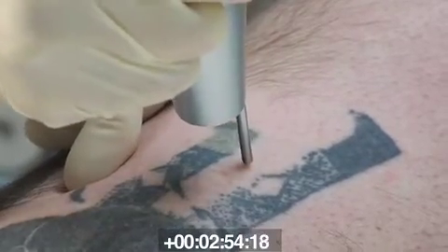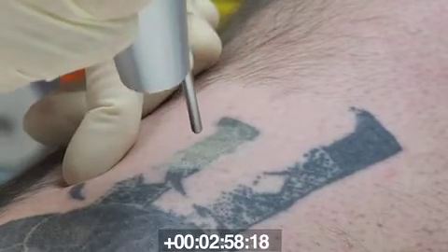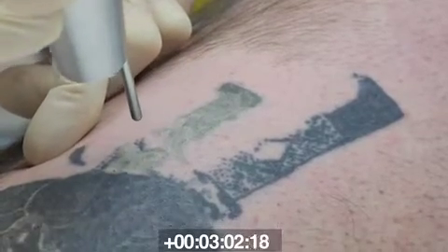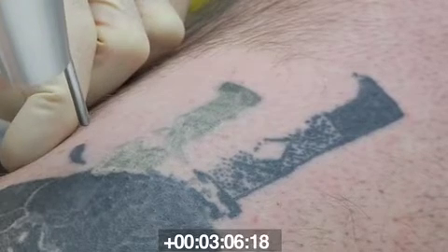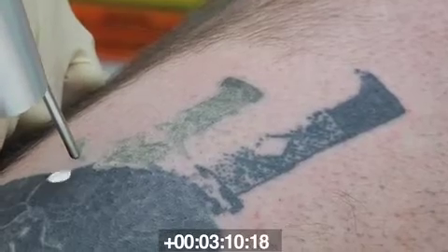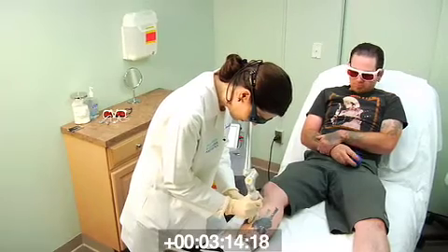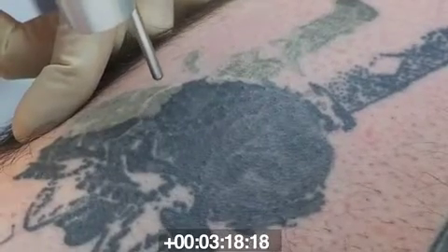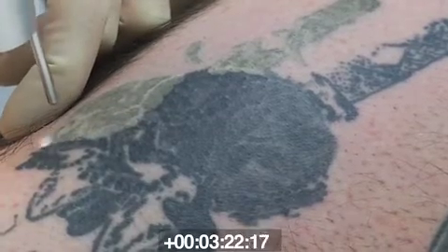3, 2, 1. And I'm just going to paint over the tattoo, airbrush over it, and cover the whole lesion. Good. 3, 2, 1. Are you breathing? Mm-hmm. Good. You tolerating this okay? Mm-hmm.